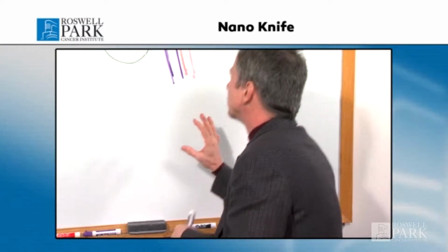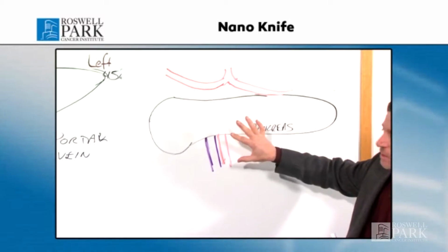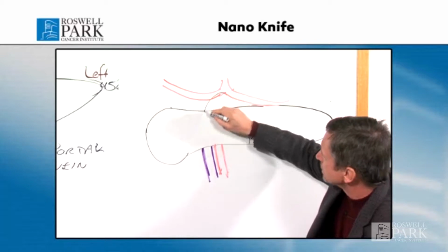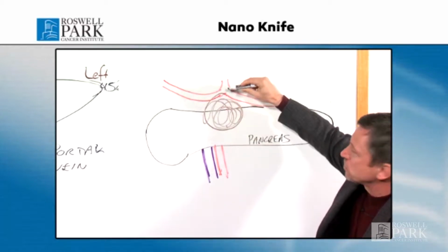I'm going to talk about a couple of situations where the NanoKnife can be used to treat pancreas tumors. As you know, pancreas tumors are best treated if they can be removed, but unfortunately there are circumstances where that may not be possible. So the NanoKnife can be used in that situation. I have a diagram here of the pancreas, and for example, if there is a tumor in the pancreas that is involving some major blood vessels.